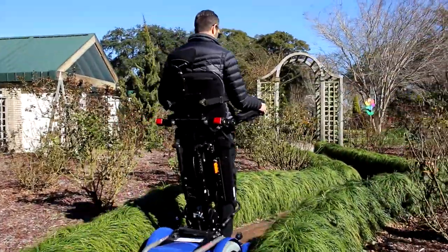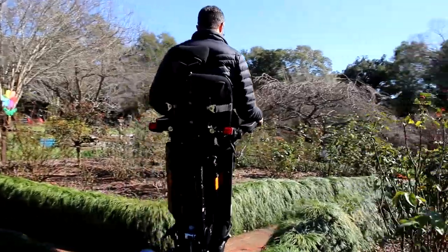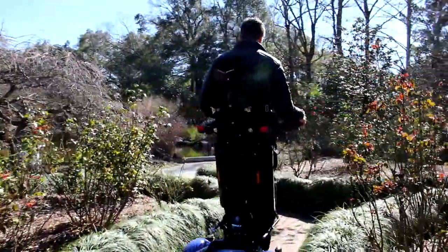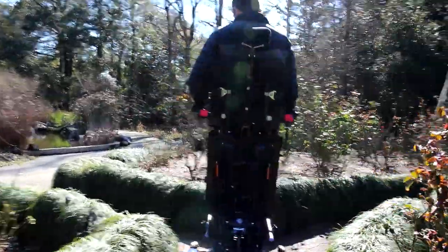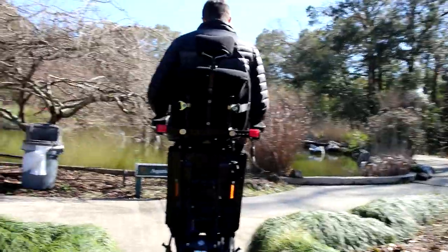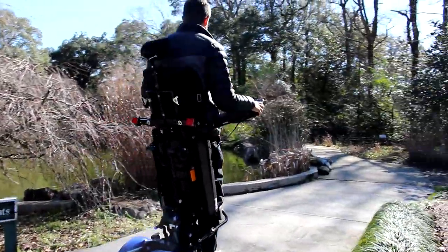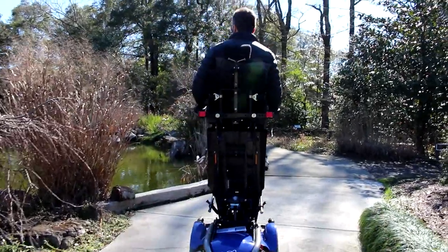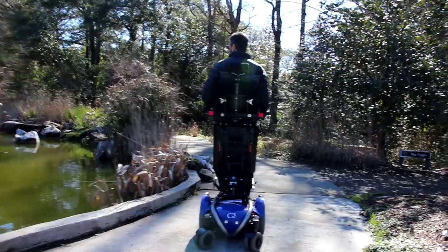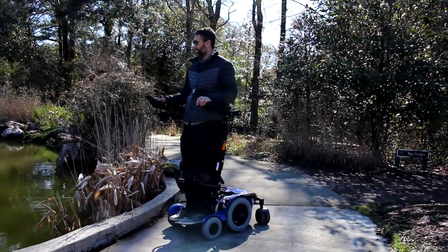There is an option for power tilt and space. However, this chair does not offer a seat elevator, power recline, or power leg rest. You can actually get a decent amount of seat elevation without paying for it — it's built into the tilt-and-space combination with the standing. So it's a very inexpensive way to get a power standing wheelchair.